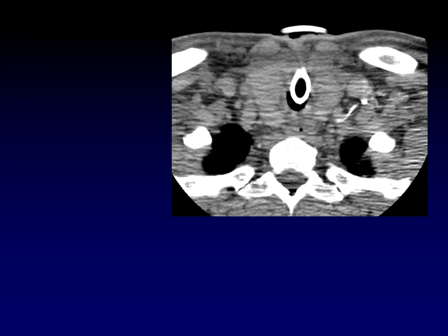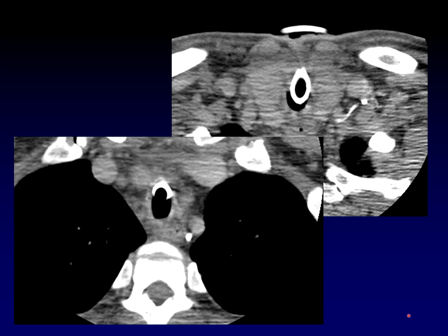Sometimes the valve that separates the thoracic duct from the venous system becomes incompetent and you get reflux of contrast into the distal duct. It's this characteristic location that gives it away as the duct and not a vein. You might even be able to follow the course of the duct down into the chest more easily when it has that refluxed contrast.